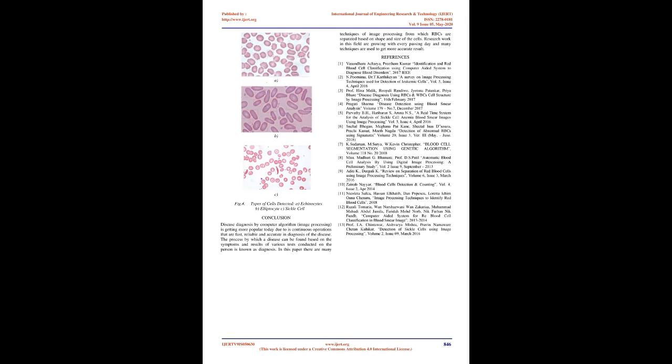In 11, paper suggests involvement of various processes like pre-processing, feature extraction, factor calculation, image processing. In the proposed method, the first step is to pre-process the images, which is an essential step. RGB images of the sample is converted to grayscale images. These grayscale images are enhanced and converted to binary images. From the resulting images, half cells, border cells are removed. Cells in the clean image are labeled. For each labeled cell, features are extracted by factor calculation, Fig.